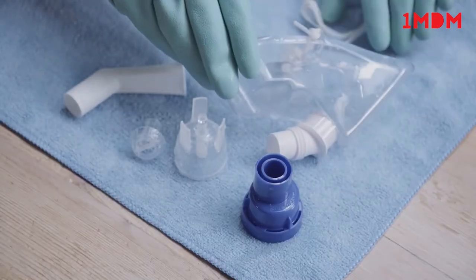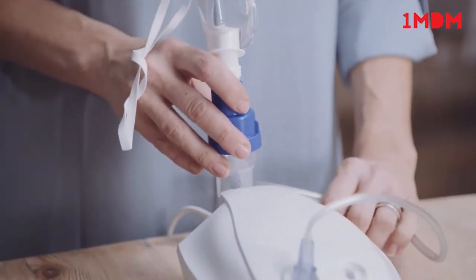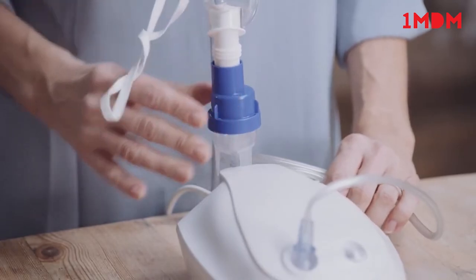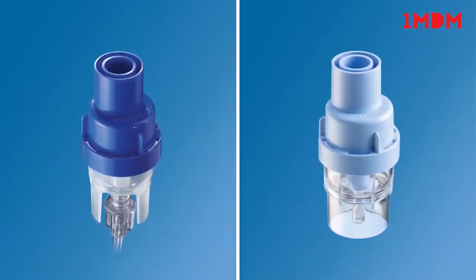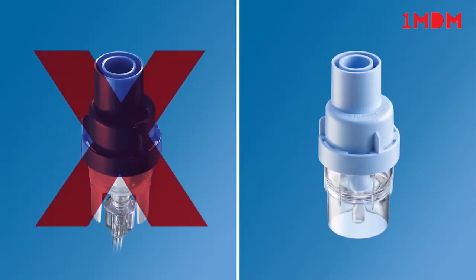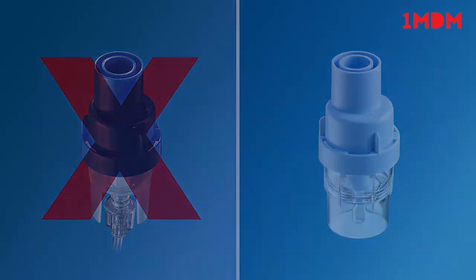Shake off excess water and allow to air dry. Do not towel dry. Reassemble and store the Sidestream in a clean place when not in use. The Philips Home Nebuliser comes with a dark blue Sidestream Nebuliser, which means it is disposable and should not be boiled. It's recommended that you replace your Sidestream according to your instructions for use.